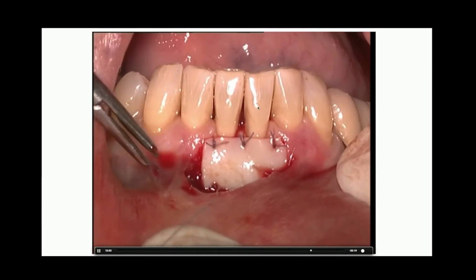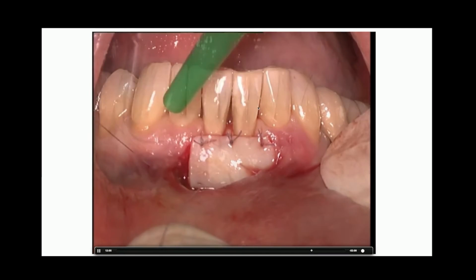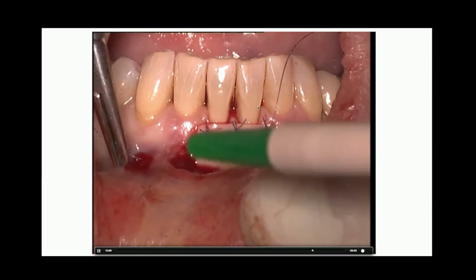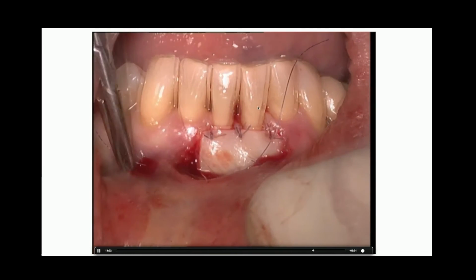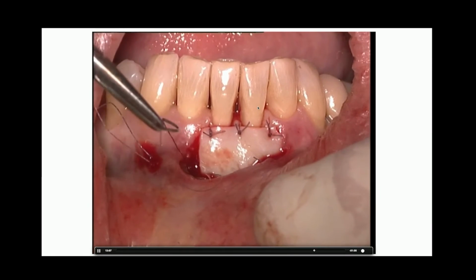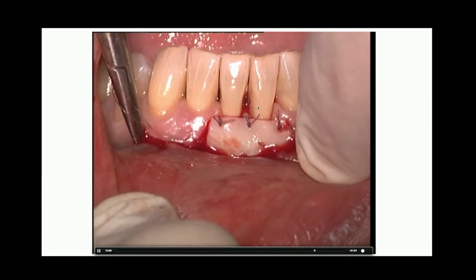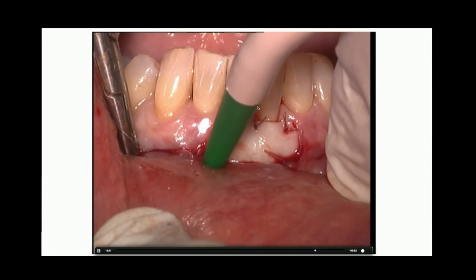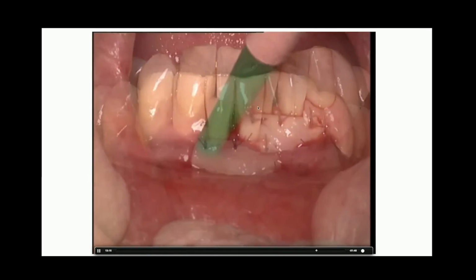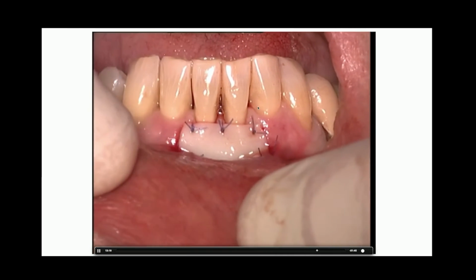The same thing is done on the other side. The needle goes through the graft and external tissues, then comes back from the external tissues, anchoring the periosteum on the way back to achieve this stretching of the graft, without piercing the graft again on the return. So now the graft is adapted and secured all around, so there's no way for the graft to move.